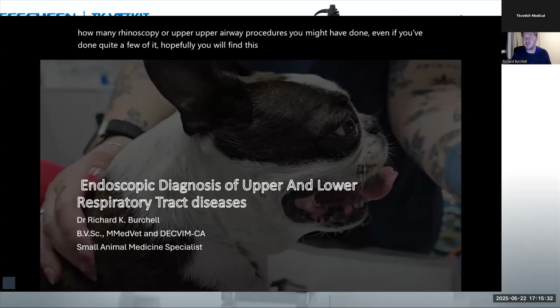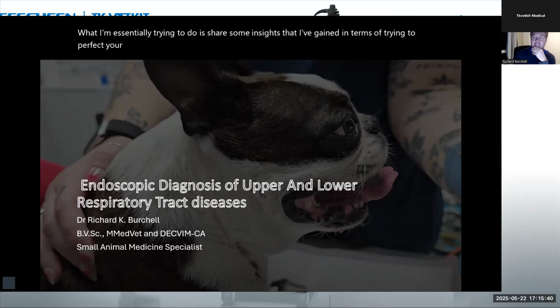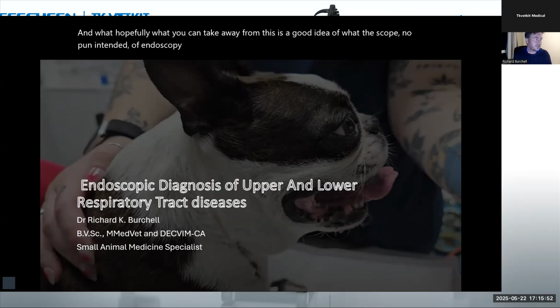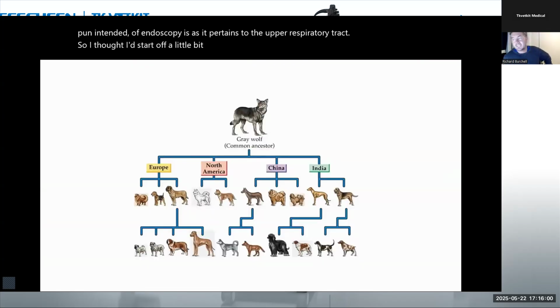What I'm essentially trying to do is share some insights that I've gained in terms of trying to perfect your skills from an endoscopy point of view. And hopefully what you can take away from this is a good idea of what the scope, no pun intended, of endoscopy is as it pertains to the upper respiratory tract. So I thought I'd start off with some basic anatomy.